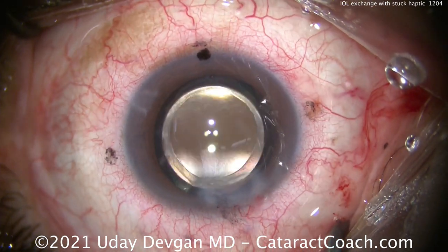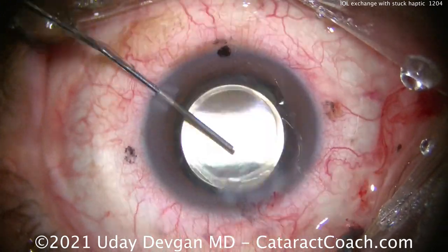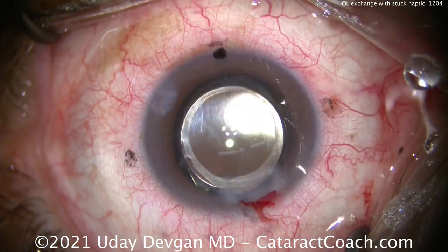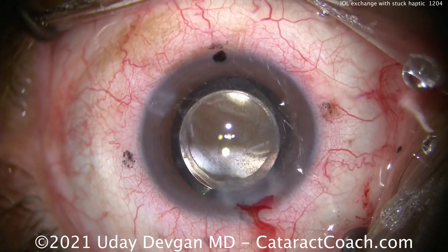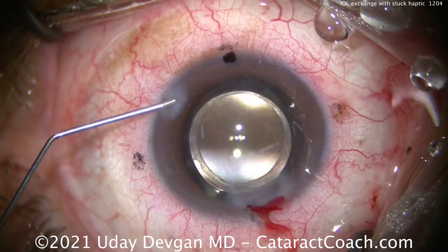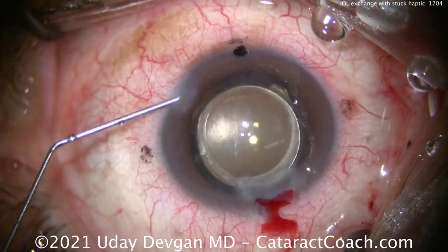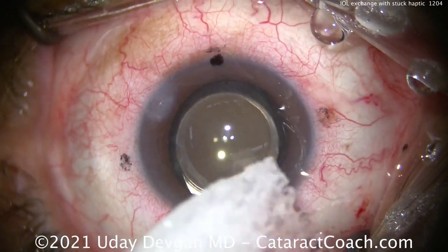A little bit more hydration, and we'll go in here to make sure there's no retained viscoelastic, because the lens is beautifully centered. We can seal up and hydrate that paracidesis as well. Now let's put some medication in the eye — there's some Triamcinolone helping with inflammation control, and then we'll also put some preservative-free moxifloxacin as an antibiotic. That looks great — beautiful result here.